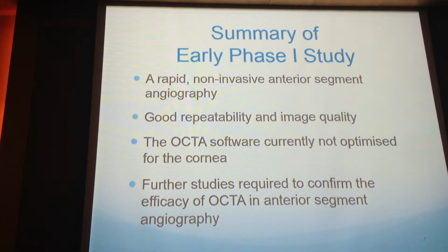So in summary, the results from our early phase 1 study were quite promising. It is indeed potentially a rapid, non-invasive form of imaging for corneal surgeons today that potentially gives you good repeatability and image quality. But of course, we needed to do more studies.